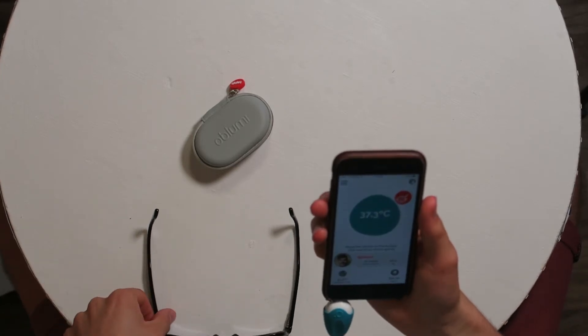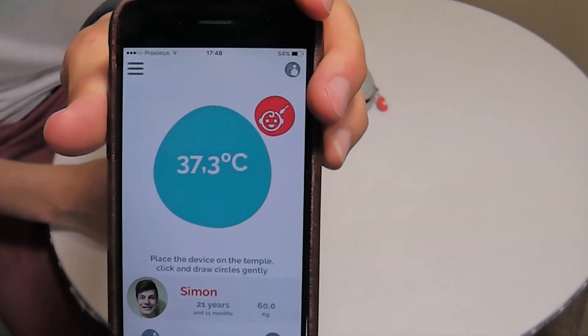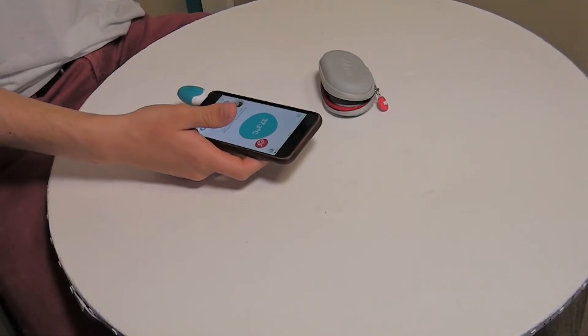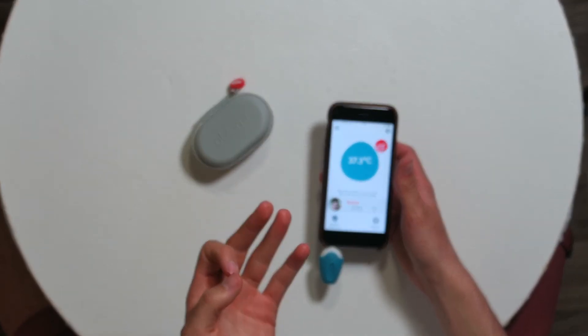It actually took my temperature — 37.3°C, as you can see here. The normal body temperature varies from 35.5 to 37.5, so 37.3 is perfect. This is very good — it works! Now I'm going to try it in my ear.